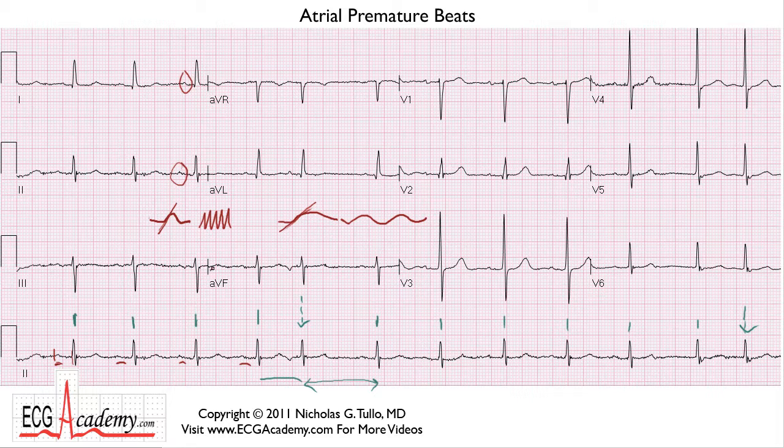If you look at the T wave from this beat, it's very smooth, and if you look at the T wave from this beat, you've got this sharp deflection at the very end of it that's clearly negative, and in fact, you can see it here in this lead as well. It's almost like the T wave here is a very broad, slowly changing signal that only goes positive, but here it goes in two directions.